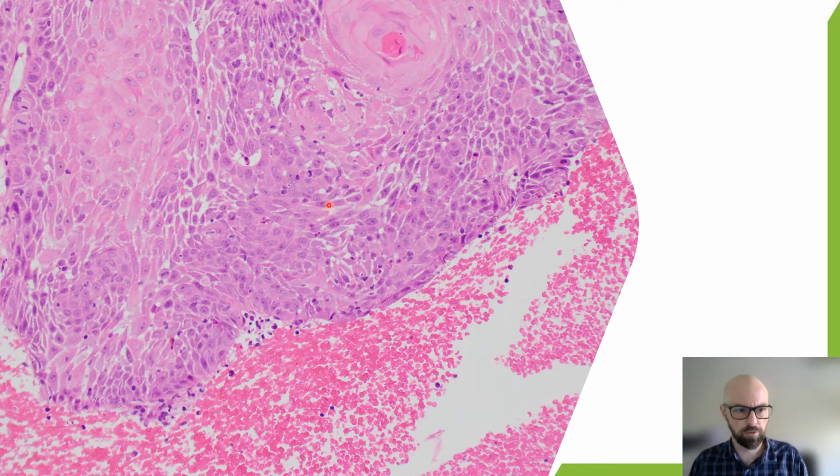And then zooming in even closer, we've got quite a lot of nuclear atypia, and they're all kind of jumbled up. There's quite a few mitoses in here. So that really is incompatible with verrucous carcinoma. Not infrequently, some pathologists get a little bit misled by verrucous appearing lesions, and conventional squamous cell carcinoma sometimes can have this verrucous appearance on the surface, and it's important not to misdiagnose.